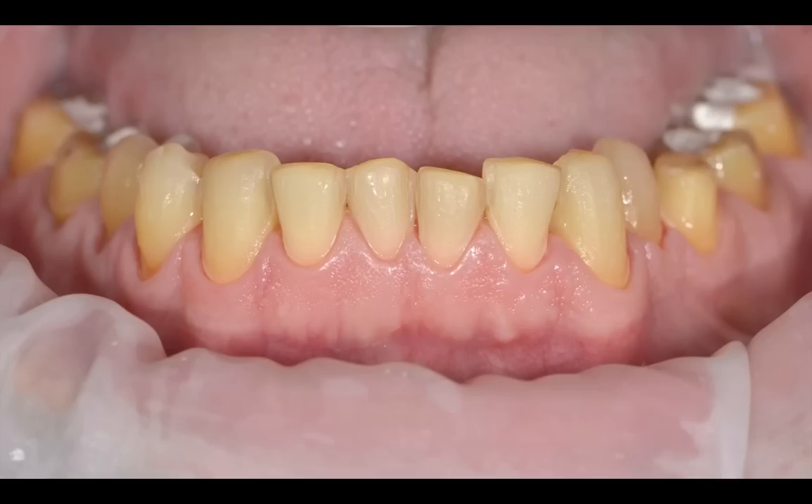So there's pretty much almost all enamel, except for in some of the receded gingival areas where there's dentin or cementum. You can see those are the preparation designs based on the diagnostic wax up. We could do another video talking about that, although I've talked about this on the webinars pretty extensively.